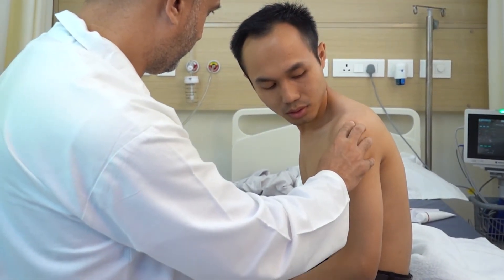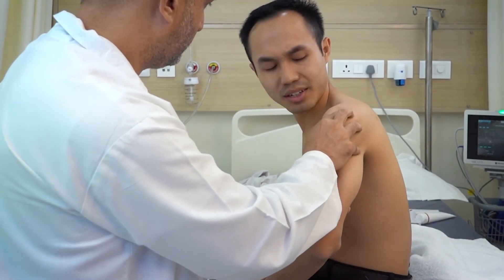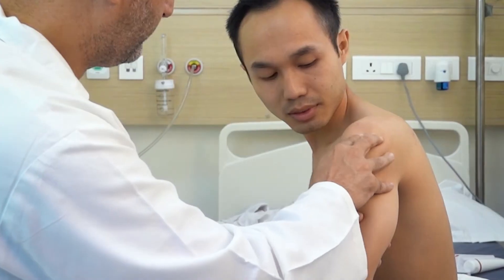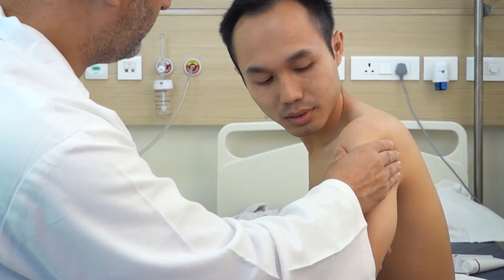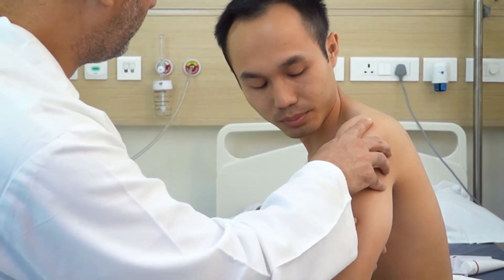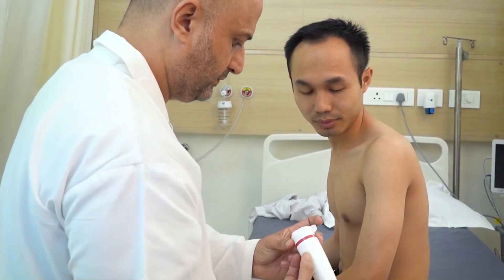Identify the tender points and concentrate the treatment with Cura laser over this area for optimum results. The surface area of the shoulder is small, so use the small therapeutic head to cover the area in a single treatment session.